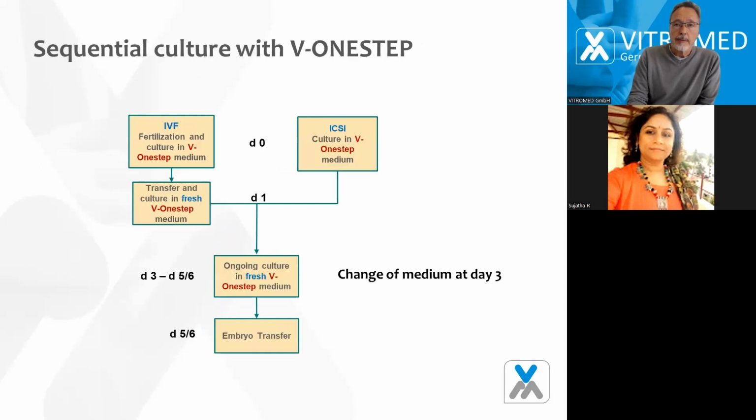Okay, but you also have the choice to use your one-step medium like a sequential medium. More or less, you can do a medium change at day 3 into fresh medium. This is more or less a gut feeling of yourself. So some prefer to do this, others don't, but it's actually not necessary. The results will be more or less the same whether you do this change or not.